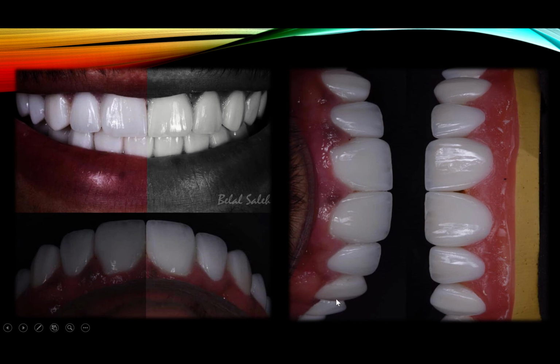These are veneers, upper and lower, very thin veneers, 0.5, 0.7 in some areas, 0.8, maybe 1 millimeter in certain areas. But I can assure you that in certain areas you can see the color of the stone here and there. It's very thin in certain areas, especially one of the canines. I forgot which one it was. I think it was this one. It's very thin. It's like 0.4.